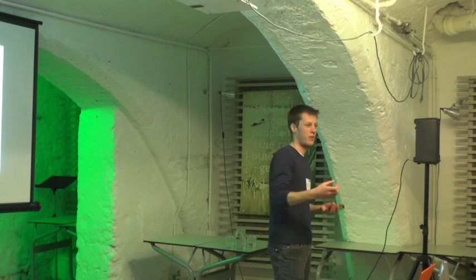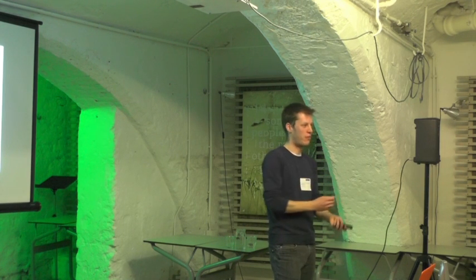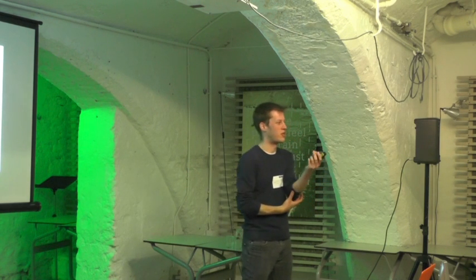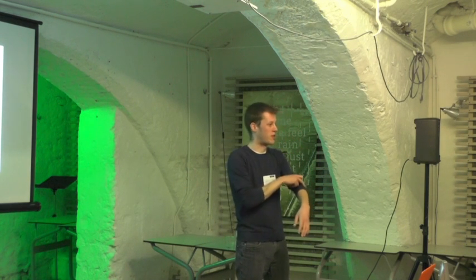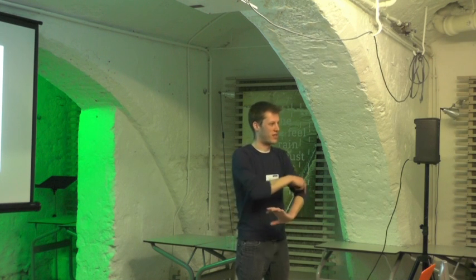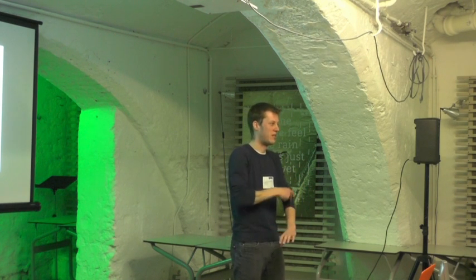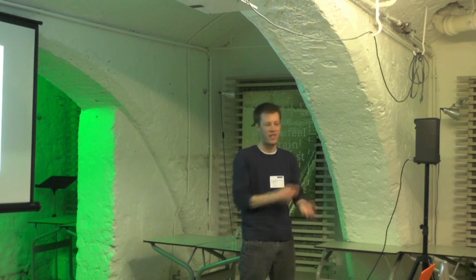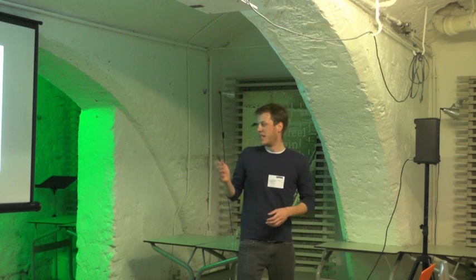Still, the intensity of the grip was coupled to the intensity of the vibration, and for opening and closing of the hand, we put sensations right next to the parts where your muscles are when you are flexing it, so that the feedback was directly, well, as direct as we could get it, related to the area where you're actually focusing your actions.